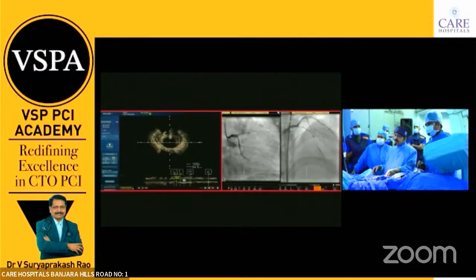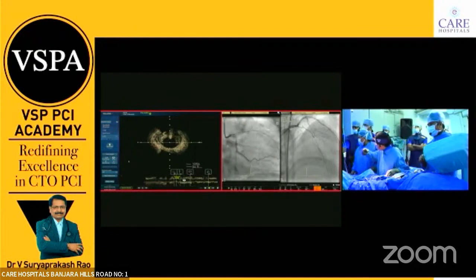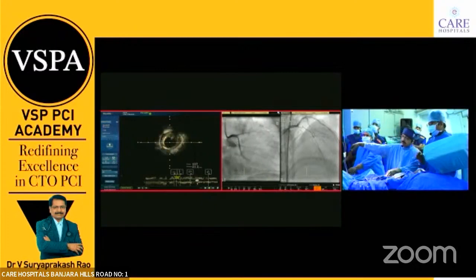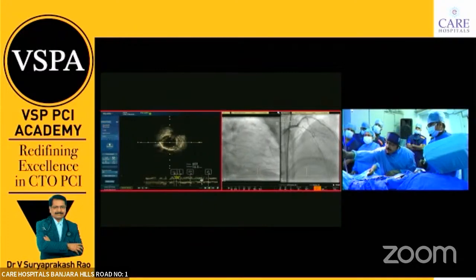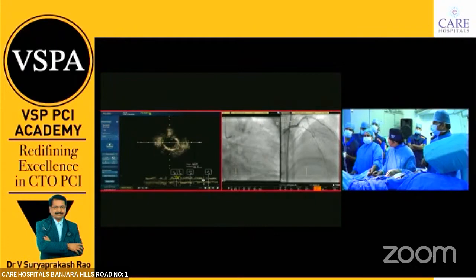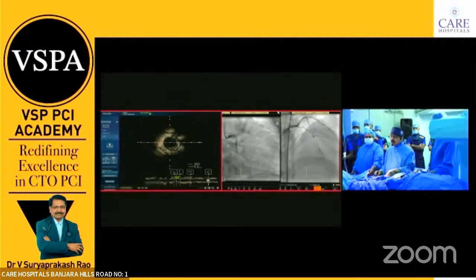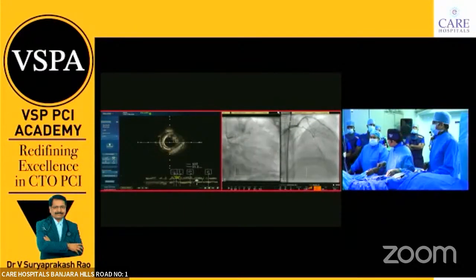We can take a 2.5 and do for both. I am looking at whether this portion fills in. Unless that vessel fills, I cannot stent. That's what I am telling you.